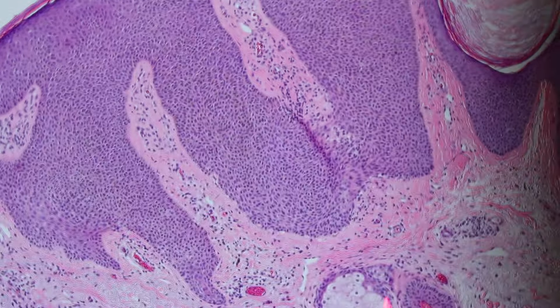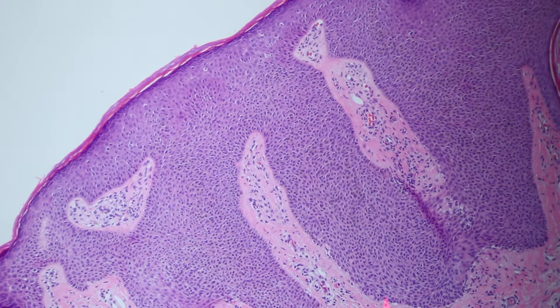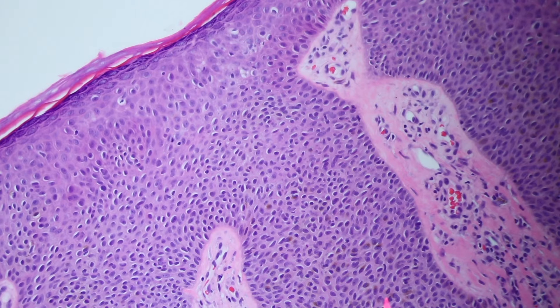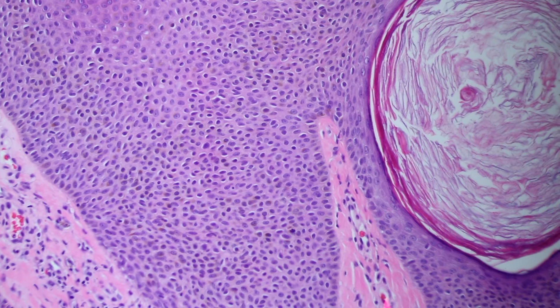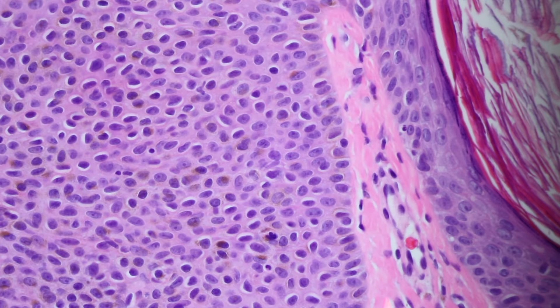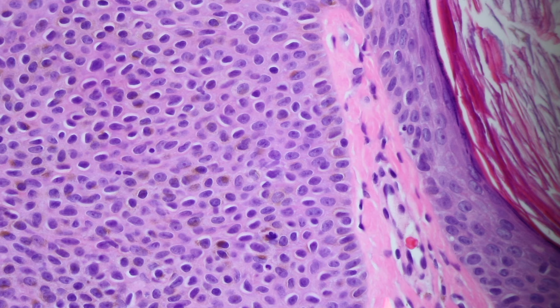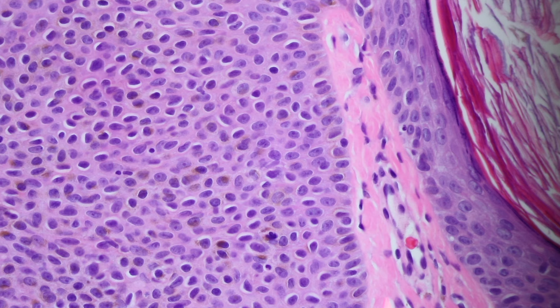The thickening of the epidermis is made of small keratinocytes — some say basaloid, though I don't love that term because they look quite different from basal cells. They're small, usually very uniform and monotonous, and they often have pigment in them, which is why these lesions look dark brown clinically. Just because they're brown doesn't mean they're actually melanocytes.